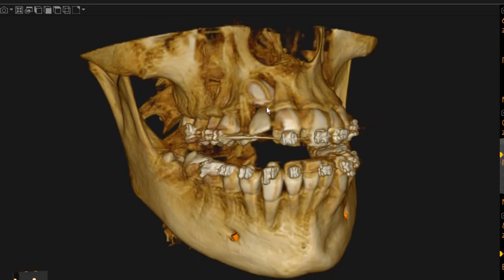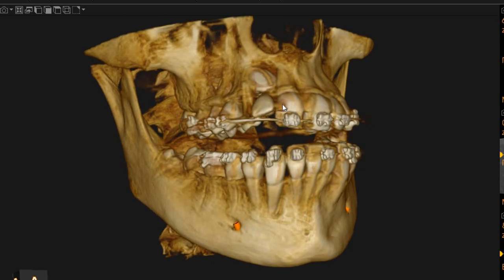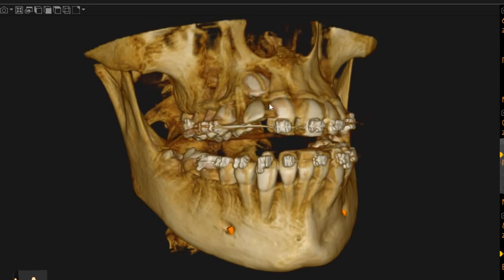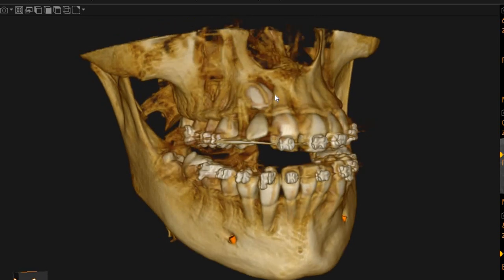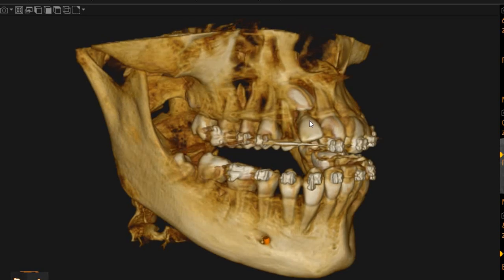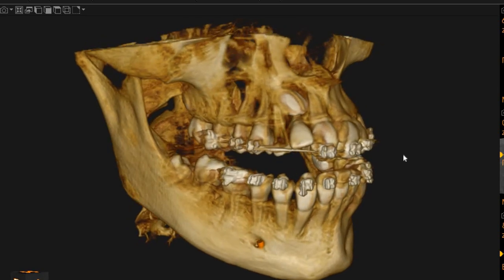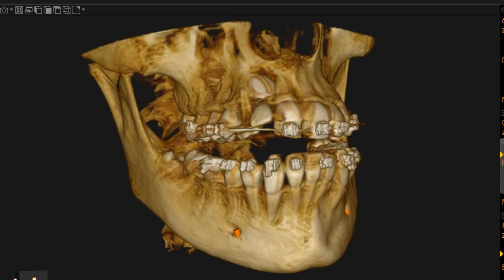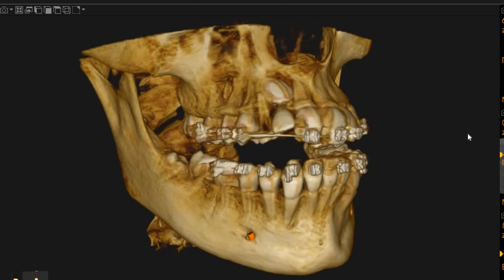On the 3D rendering, you can see that the lateral incisor is coming in quite horizontally. The upper right canine is placed in the maxillary bone, and the deciduous canine is also present with a little bit of resorption that can be seen in the coronal section.